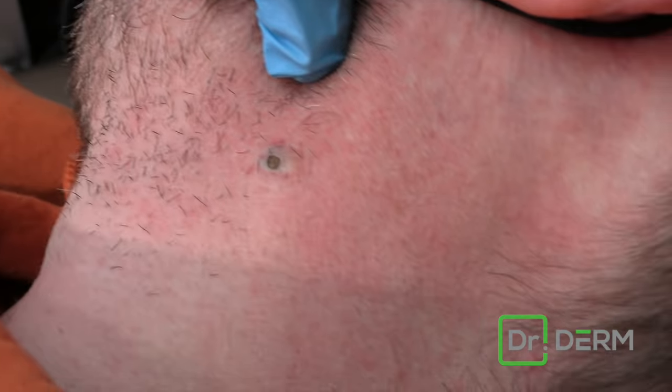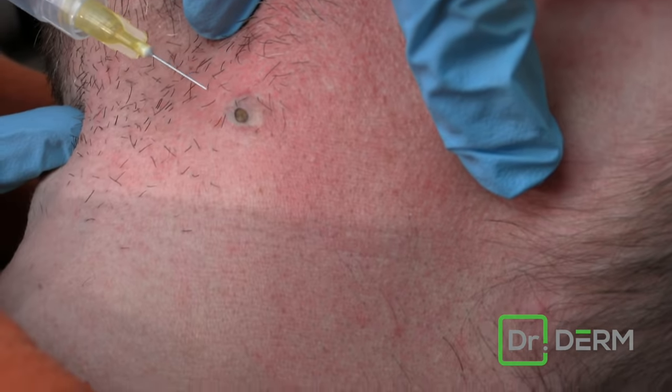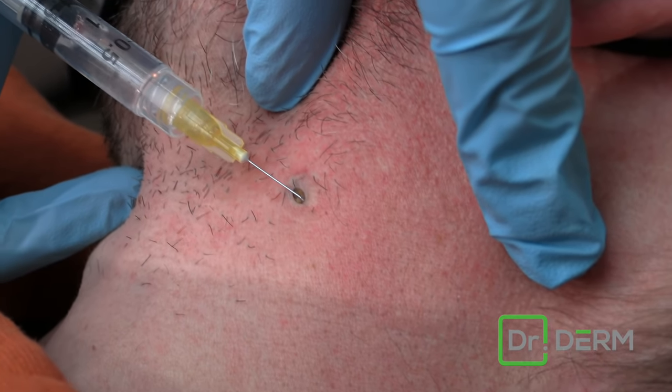So we have this pore of Winer on the neck, and we are ready to take this out. Let's do it. So we've cleaned this off. We're just going to do a little tiny numbing.